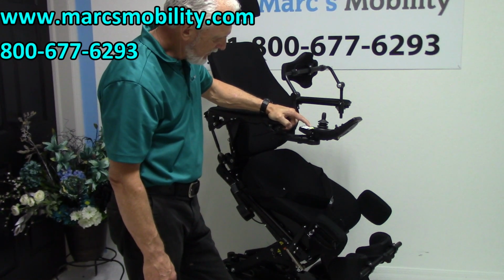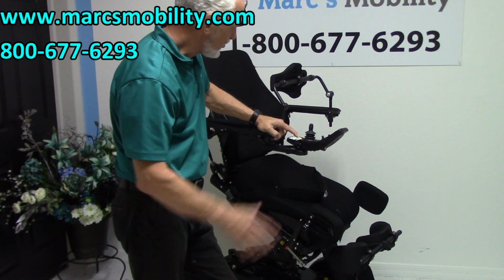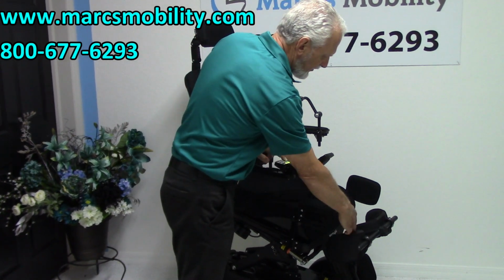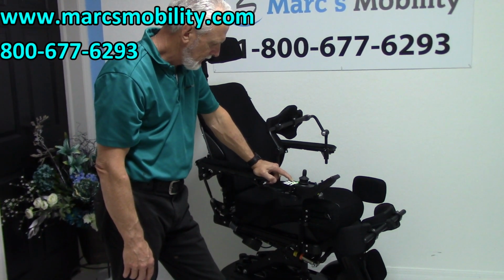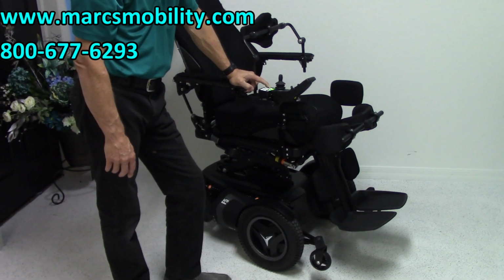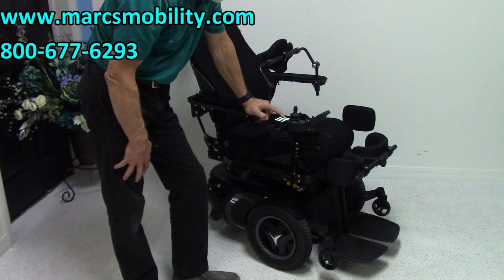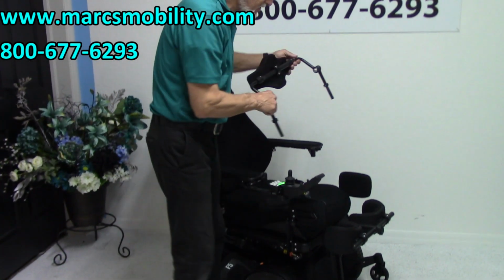So the standing position is good if your physician recommended you stand up, and this would definitely help you stand up. This is not one you can stand up and walk out of because your knees are braced and your chest is braced. So, see the wheels came off the ground now? And now the seat's going to go all the way back down to normal. And I'm still holding the button down until it's all the way down. And you'll hear it when it's all the way down. So when you're down, you can take your chest guard off.